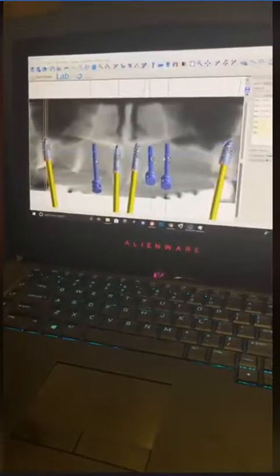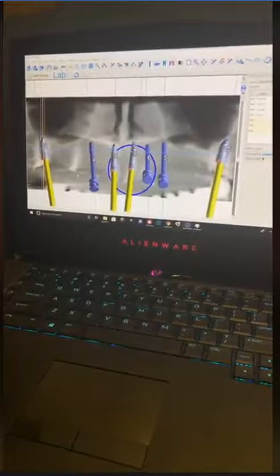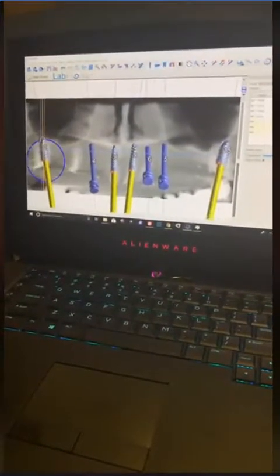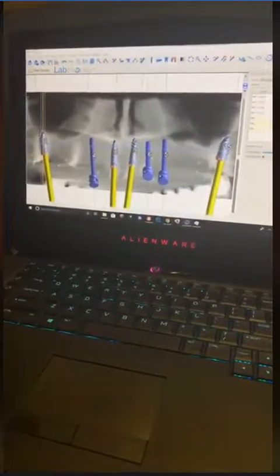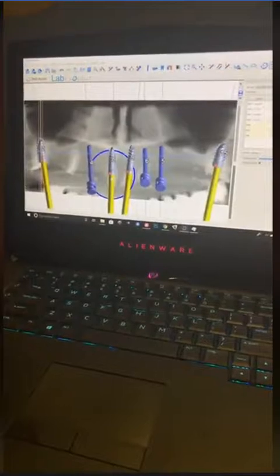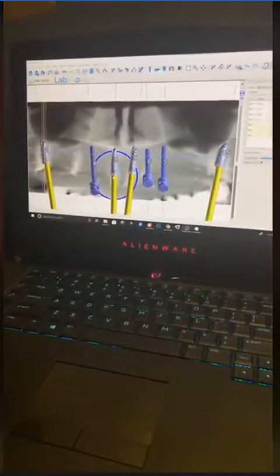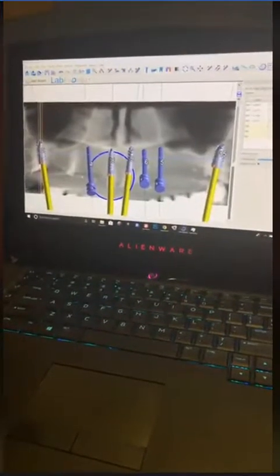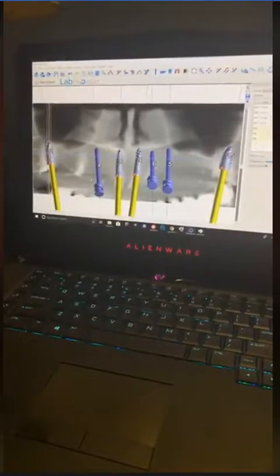And these are my fixation pins that you just saw on the guide. So that is my plan. Now, generally speaking, most people do not spread the implants this far apart. And I don't either, but you know what? You really don't have much of a choice in this particular case. You're really stuck. You're not able to do anything more than this. But this will give the patient a really nice, beautiful, stable implant.